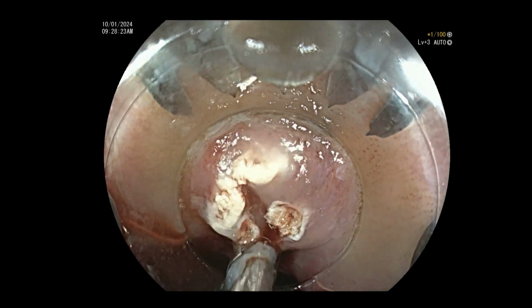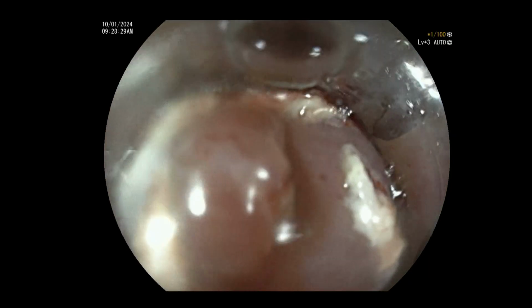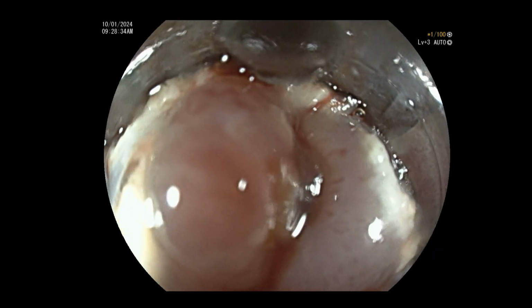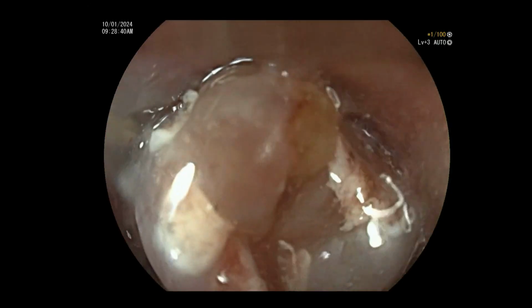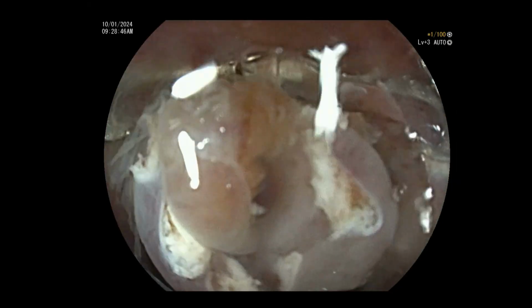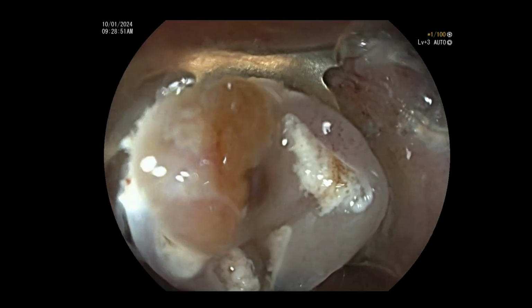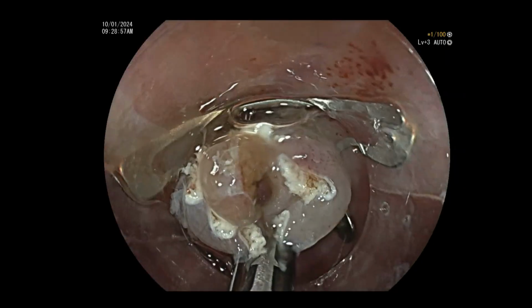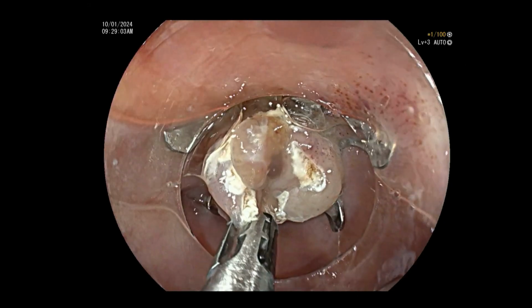We re-entered with a 17.5 mm teeth ovasco loaded. We also used the twin grasper to grasp the lateral aspects of the defect and suction the whole fistula into the cap. Following this, we deployed the ovasco and achieved closure of the defect and fistula. We then released the twin grasper carefully and inspected our ovasco.